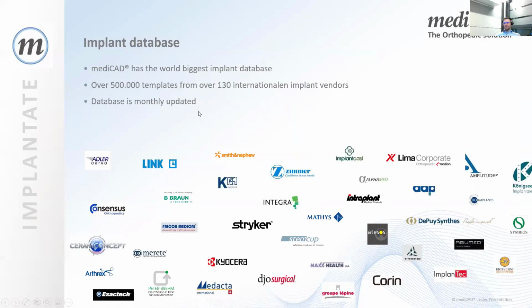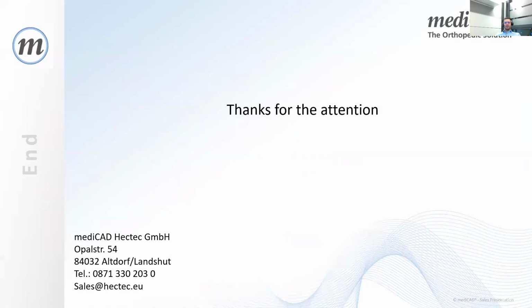It is updated mostly monthly. If there's an implant you use that is not in the database, we do our best to get this information into the software so that you can plan with the implants you're using. This is a very big part of our software. Thanks for the attention, and then I would say we go straight into the software.